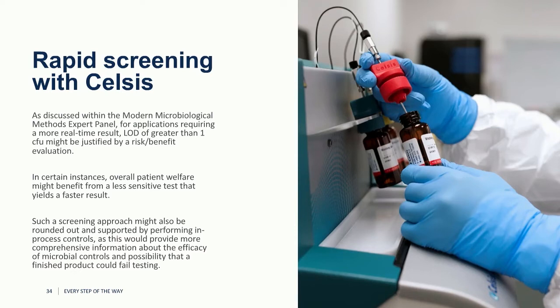Some modifications to protocol would need to be made, but of course, a very quick test would be able to be carried out. And so we would also recommend that maybe in lieu of only doing such a screening test right at the point of release or right prior to release of the product, you could round out this screening approach with in-process controls. This would provide more comprehensive information about all those different microbial controls that are put in place when a drug is compounded or manufactured, and would give increased assurance that a finished product wouldn't have failed that traditional testing, that typical sterility test itself.